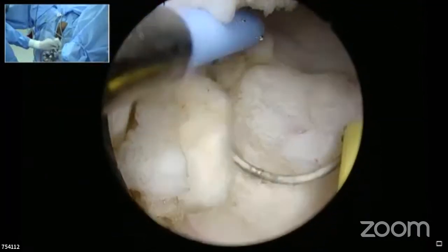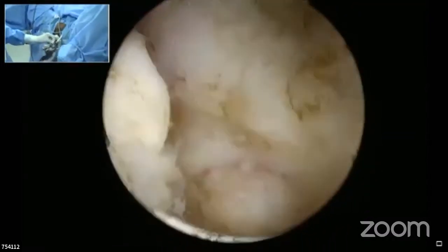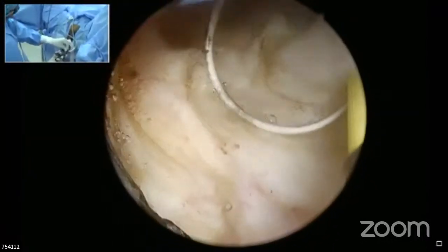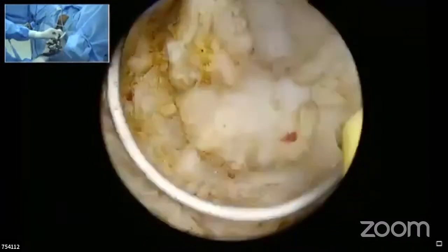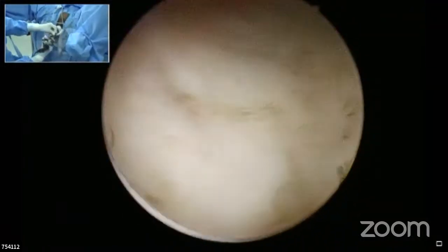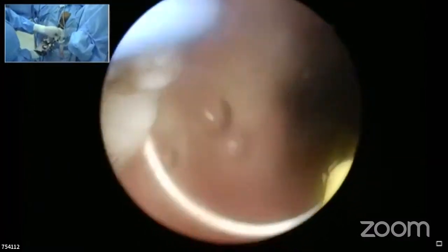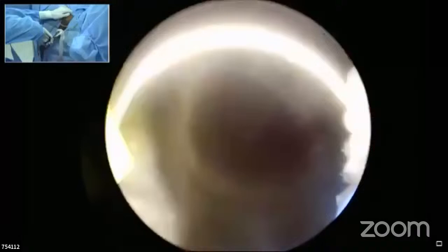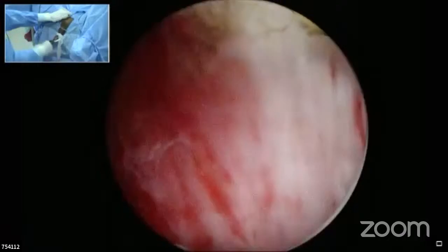So I'd like to complete one lobe, then move to the other lobe. Why is this also important? Because if something happens and you have to stop, you can come back another day and complete your other lobe then. Yes, sir. Very good.